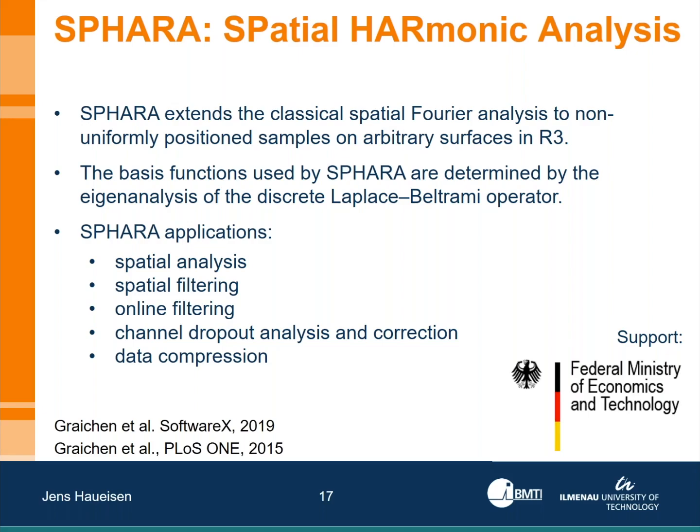With this, you can do many things. You decompose into basis functions, and those basis functions are orthonormal, and that means you can do at the end quite a number of different things with SPHARA applied. Spatial analysis, spatial filtering. You can do online filtering because it's extremely fast. It's in the few milliseconds range that you do the filtering. You can do dropout analysis and correction, and this is what I will demonstrate in the next few slides. And you can do data compression, but I will not touch on this last point here.